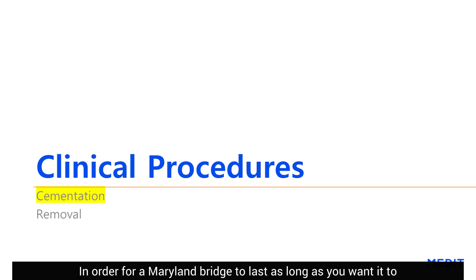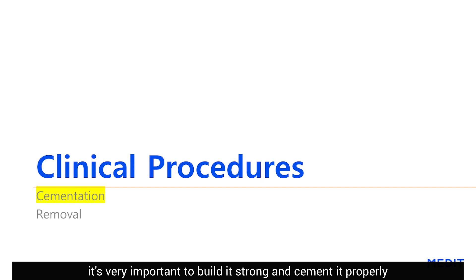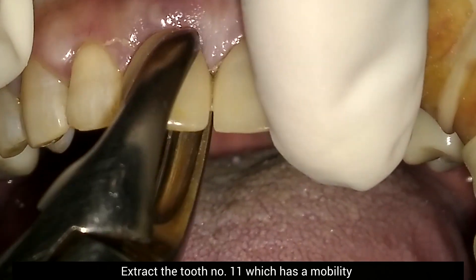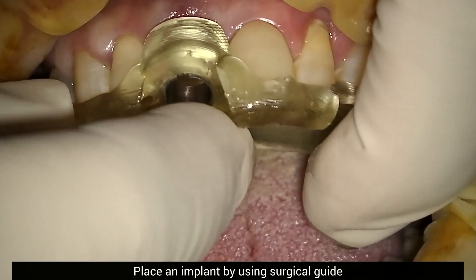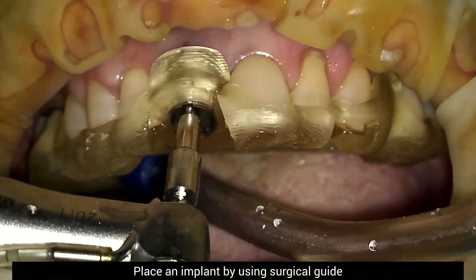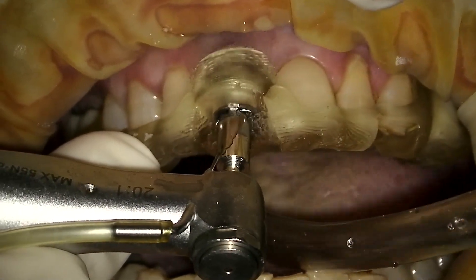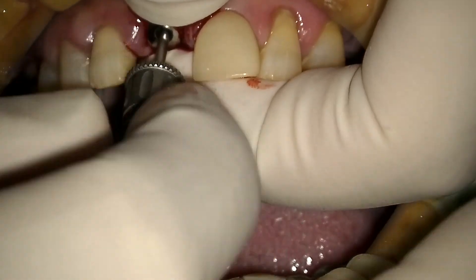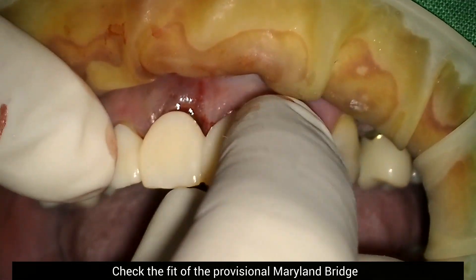In order for a Maryland bridge to last as long as you want it to, it's very important to build it strong and cement it properly. Extract tooth number 11 which has some mobility, place an implant using a surgical guide, and connect the healing abutment. Check the fit of the Maryland bridge.